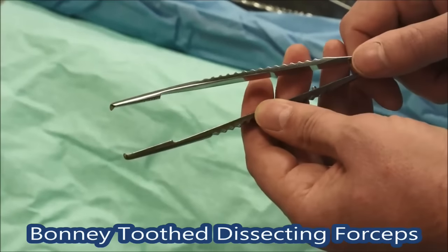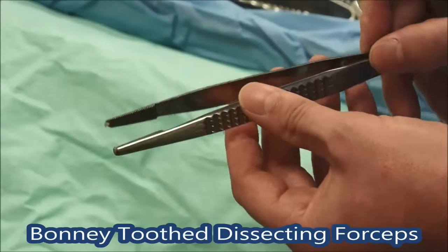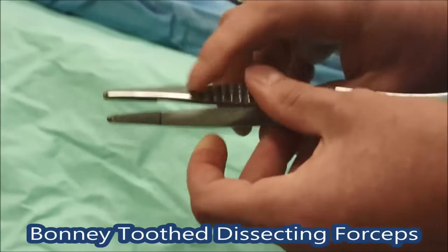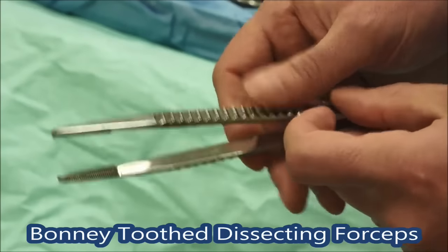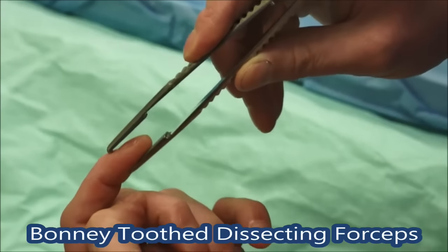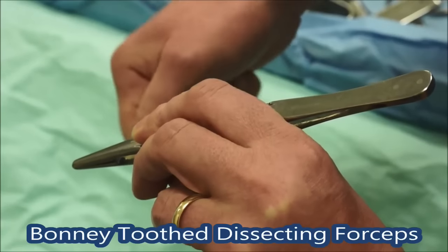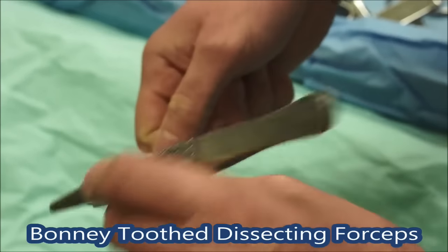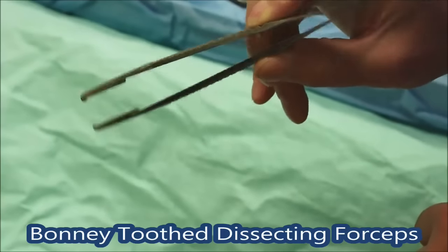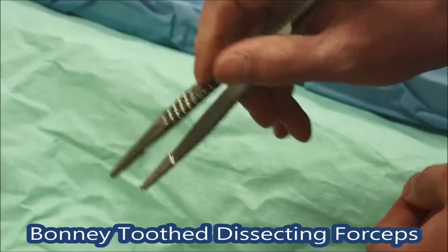On this tray we have these forceps here, which are really quite large and bulky — these are called Bonneys. They've got teeth on them and are for grasping tissue. We use these for getting hold of the rectus sheath when we're closing the abdomen — get hold of the rectus sheath, lift it up, and then pass the mass closure needle through and grab it again, so you're not using your fingers to pass things through. They're called Bonneys, and again they have nice corrugated bits to hold on to so you don't slip.